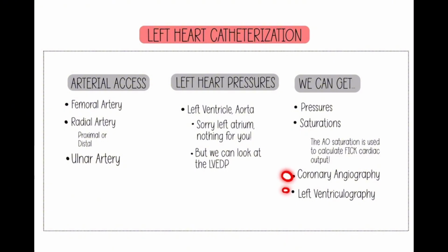So we're going to do coronary angiography and left ventriculography, or an LV gram, to look at the coronary arteries and the left ventricle. Now, can you do pictures for a right heart cath? Yes. If we are doing one for a PE, pulmonary embolism, to remove that thrombus, we might take, well, I guess it's a venogram of the pulmonary arteries. In pediatrics, some patients are getting treatment for pulmonary stenosis because it's usually congenital. They could take pictures of the valve from the right ventricle and inject there.